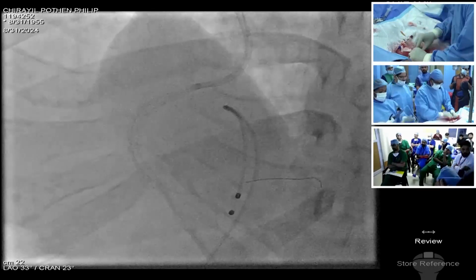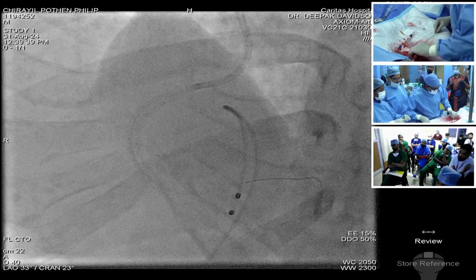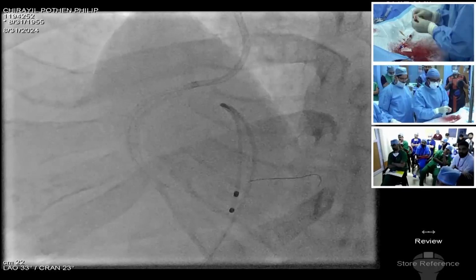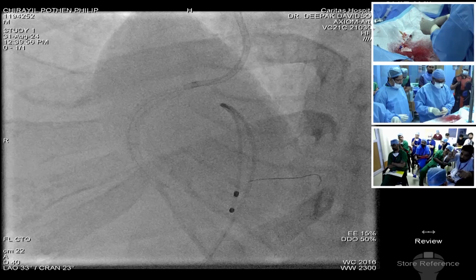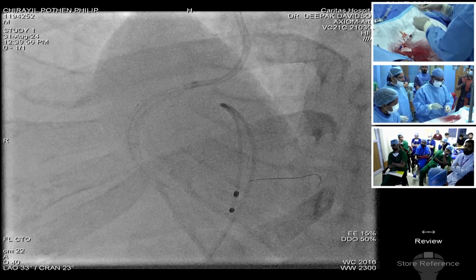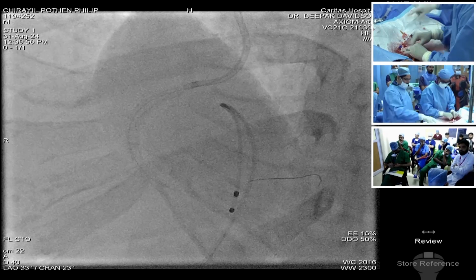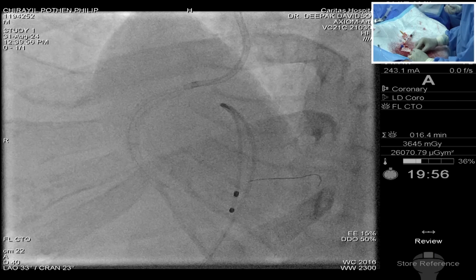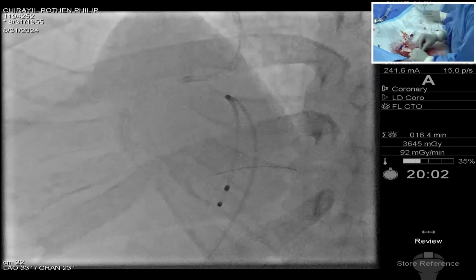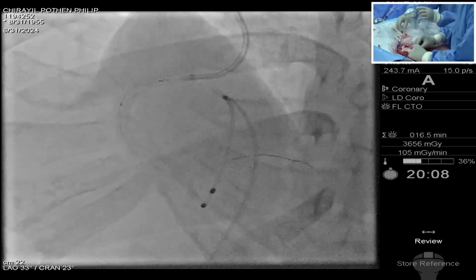A small purge. Reduce noradrenaline. Show the OCT image, enlarge the OCT images.